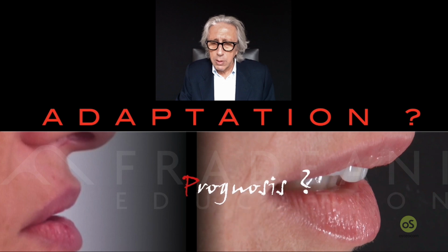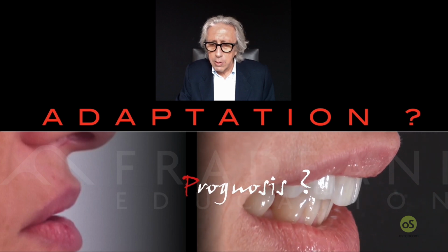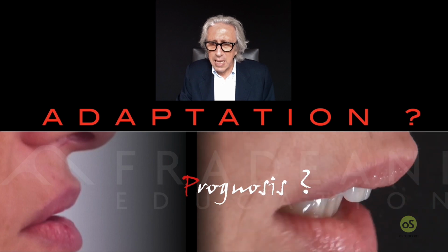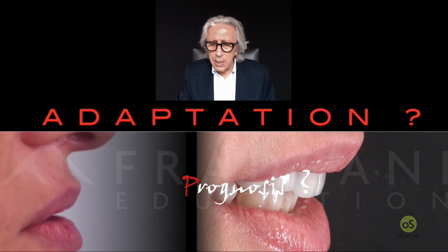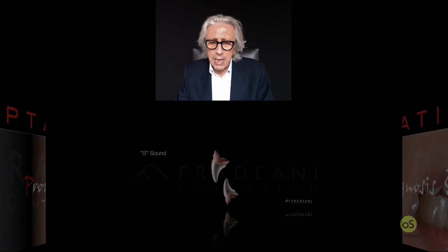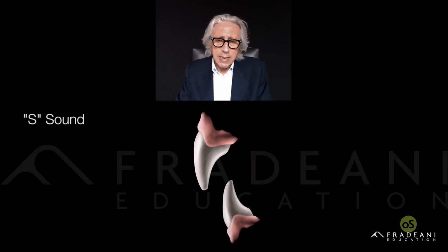Take a look now. Now, she is not going in front anymore. She's staying back. She has transformed the horizontal movement into a vertical movement. It does allow you to achieve a good result. That happens in 90% of our cases. Don't be wrong. Don't be afraid. That can happen.